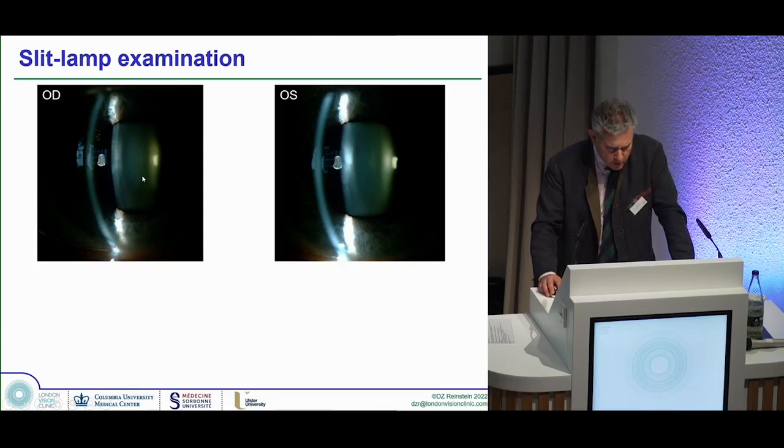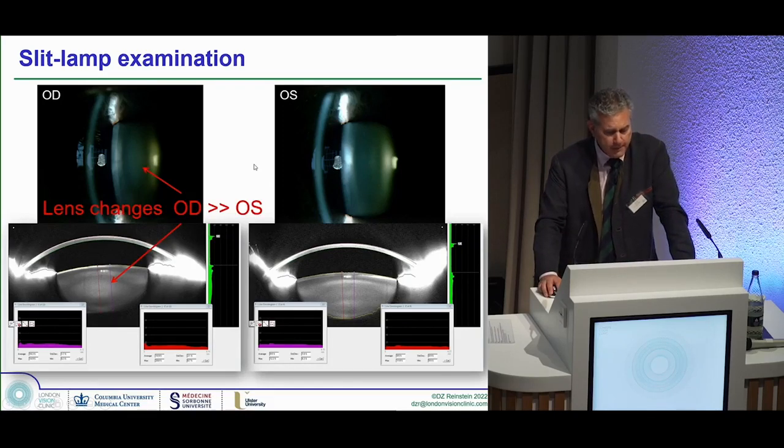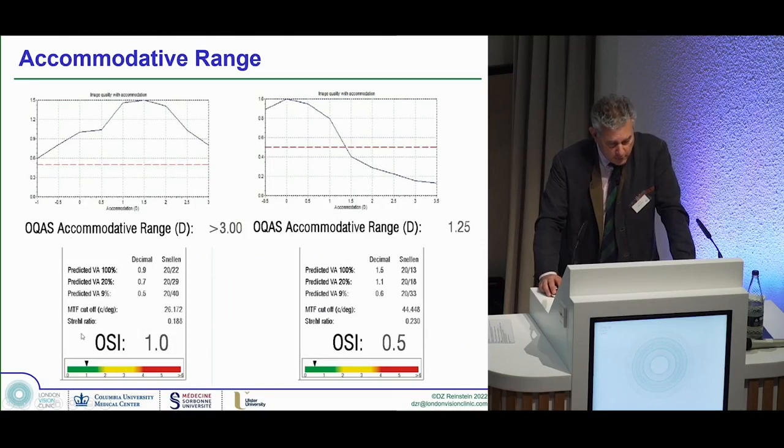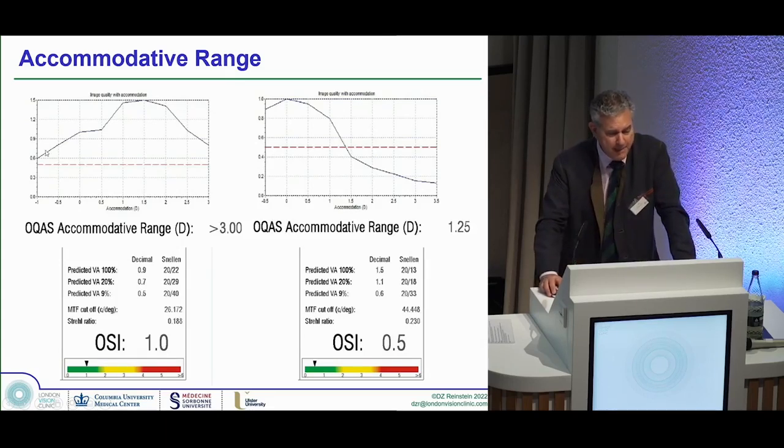Lenses were as you'd expect, perhaps a little bit of nuclear changes there, which might explain the minus 4. There's a little bit more nuclear shift here compared to the left eye, so she might have been minus 2 in both eyes before. Her depth of field was huge in both eyes already. So these little nuclei in her cataracts are already giving her massive depth of field.